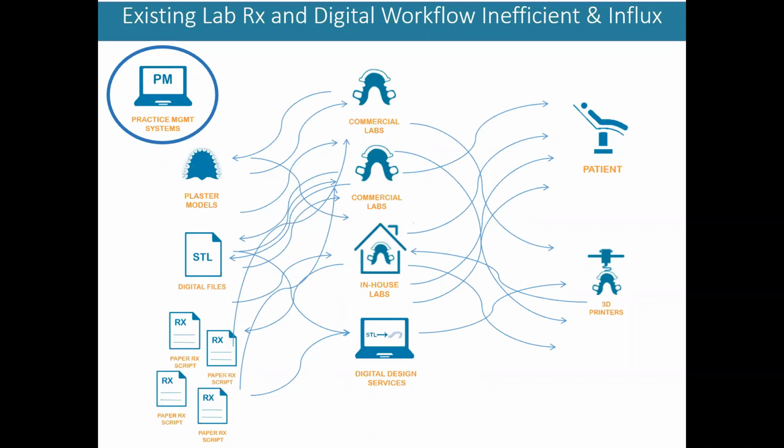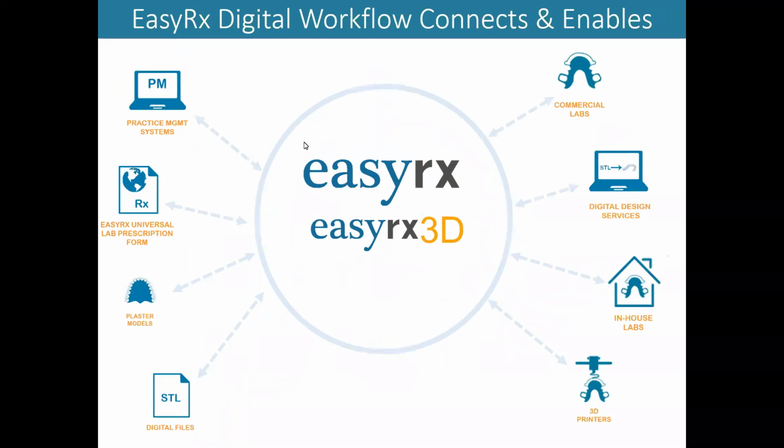Maybe you have a notebook that you keep track of cases in, or an Excel spreadsheet, or we're putting appointments or delivery information into our practice management software. But really nothing talks, none of the software or technology we have communicates. And the idea was to really give practices one platform where we work with your practice management software, we work with your commercial labs, your digital design software, your in-house lab, and bring all that into one platform.